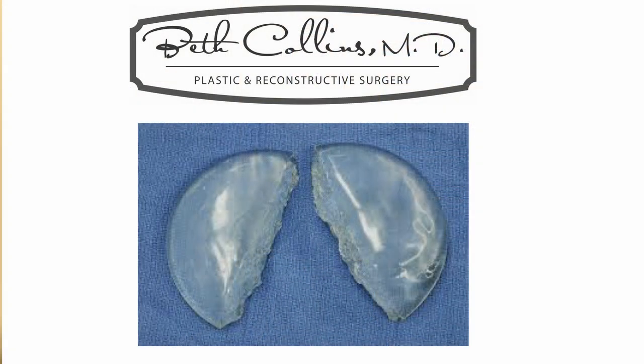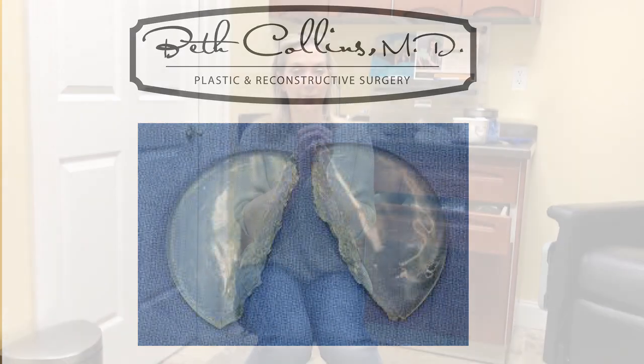So if you have a saline implant in there and it ruptures, you know it instantly because your breast will just flatten out to nothing and it'll be quite obvious that it happened. In a gel implant, if a rupture happens, it's just contained within the capsule of that breast. And I'll explain to you what a capsule is. But it's contained in there, and sometimes you don't even know it's happened until you either get an ultrasound or mammogram for cancer screening, or you may notice that there's a little bit of a change, but it's not always so clear.